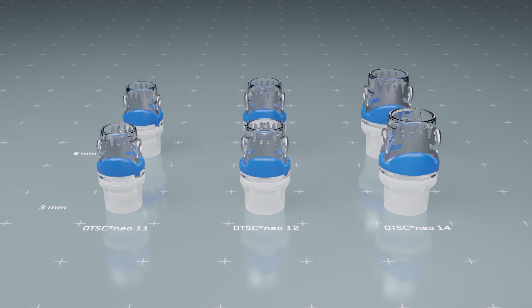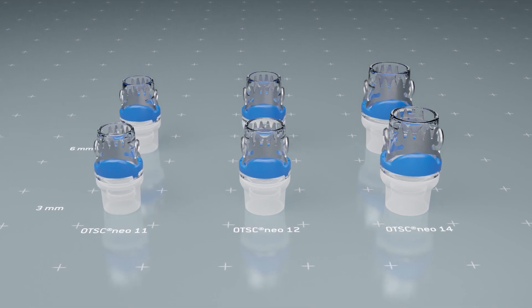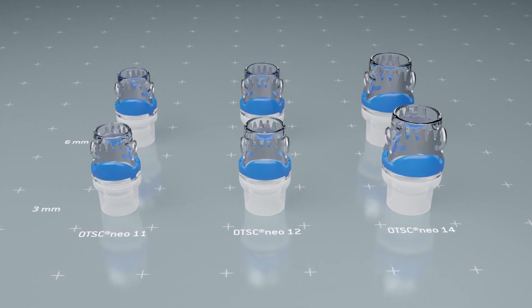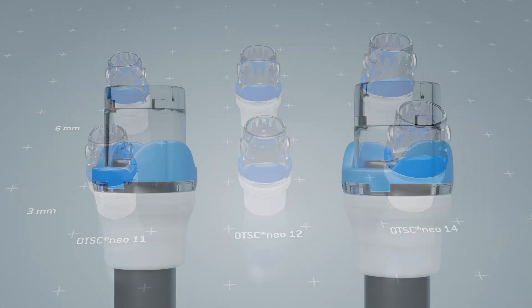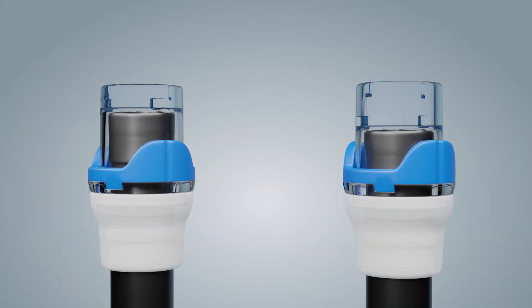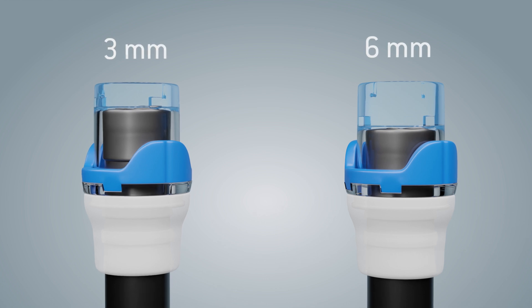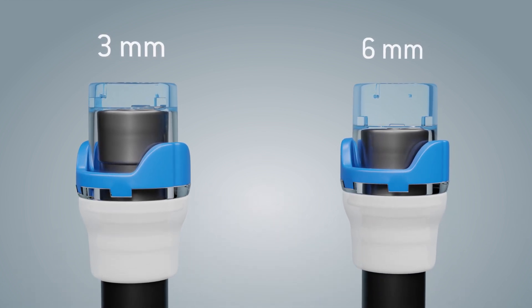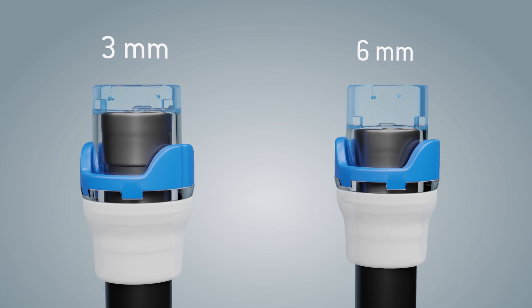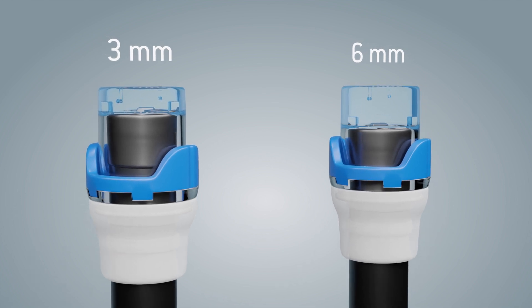The clips are mounted on matching application caps. The caps are available in system sizes 11, 12, and 14, and all three sizes are available with a cap depth of 3 or 6 millimeters. The appropriate clip type and system size is selected by the user and depends on the requirements of the respective procedure.